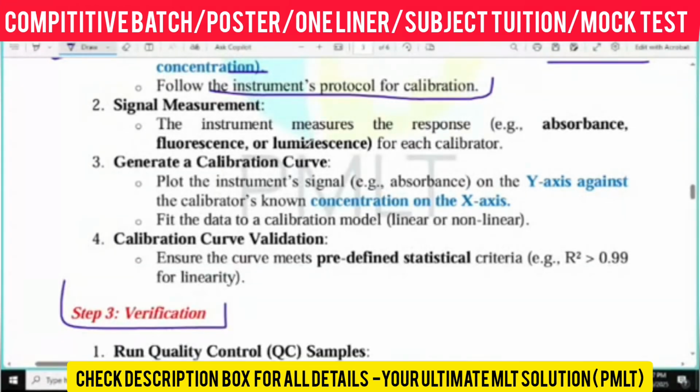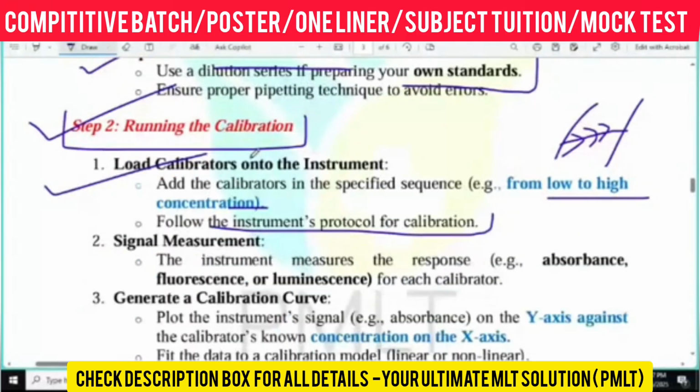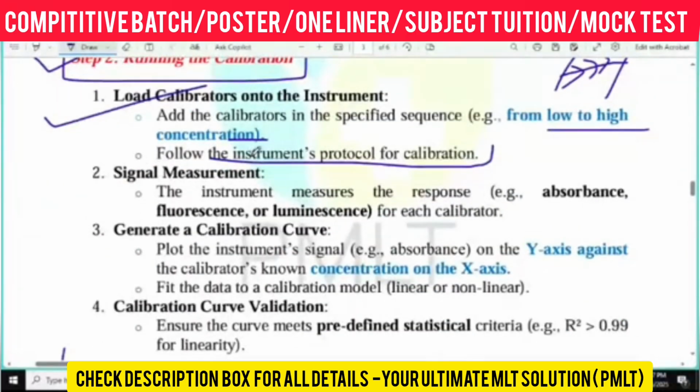So you have already run the calibrator. Second, signal measurement. You have to measure the signal, like absorbance. If we are doing any kind of fluorescence test, then we have to measure the fluorescence.